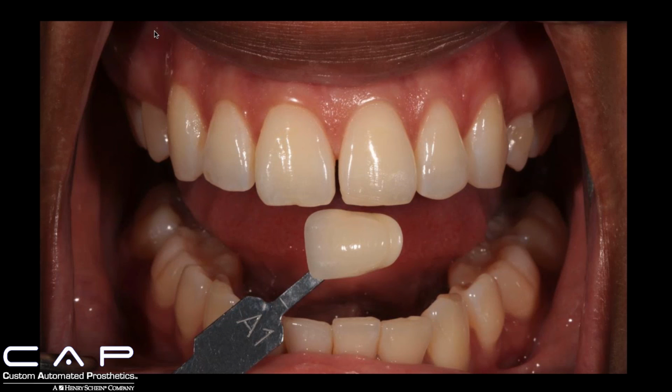And when I'm picking out my shade tabs, I often pick out a shade that's too light or too dark, or the value's too low or the value's a little too high, and I take a photo of that as well. That way I can see where I have to draw the line as far as hue, chroma, and value. On the next picture, you'll see a picture of the B1 shade tab, and it's not quite right, but it'll be useful to me because I'll know where not to go or where my limitations are with this shade.